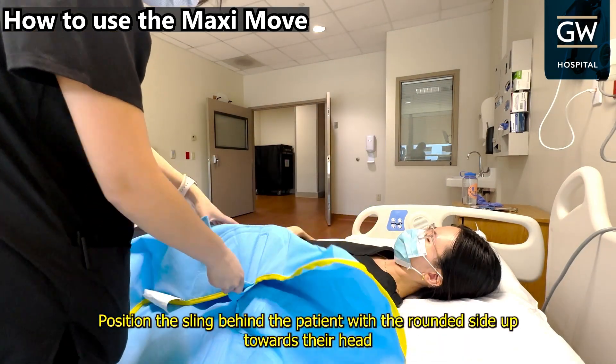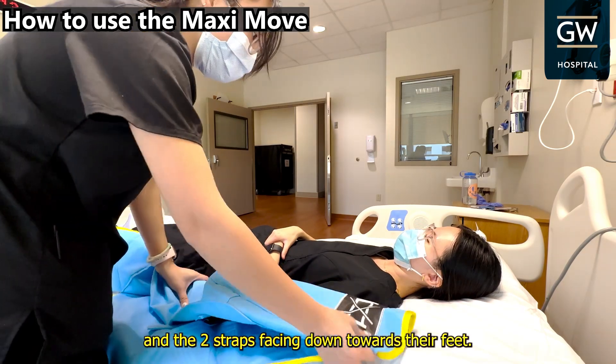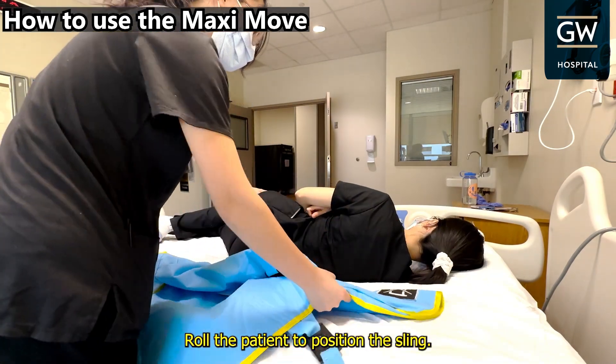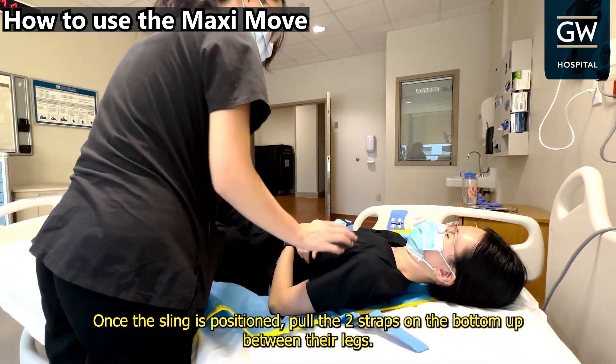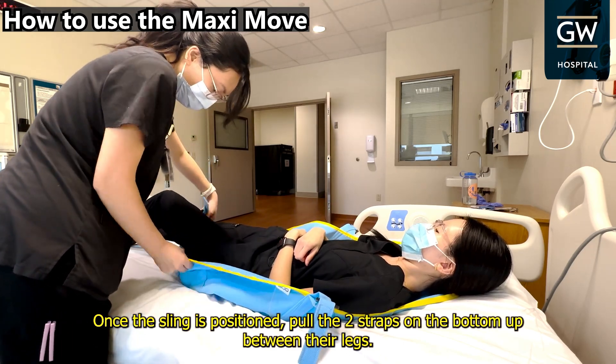Position the sling behind the patient with the rounded side up towards their head and the two straps facing down towards their feet. Roll the patient to position the sling. Once the sling is positioned, pull the two straps on the bottom up between their legs.